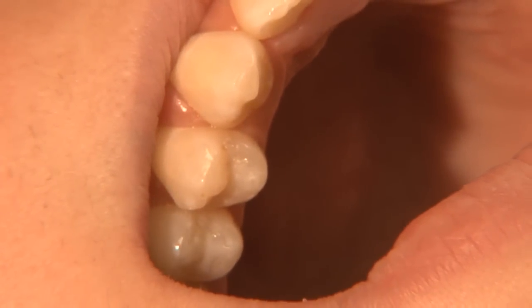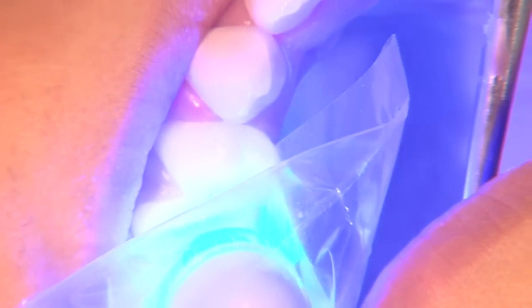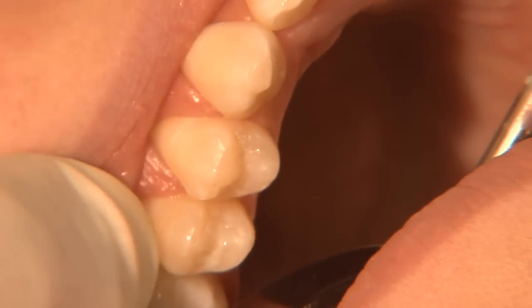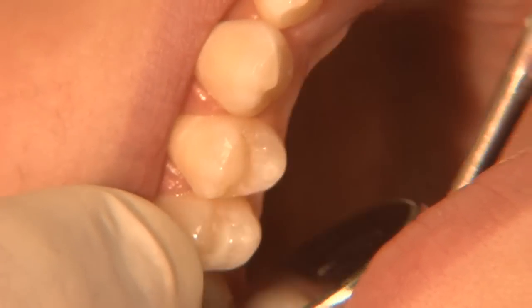After it has been properly placed, it is then light cured for approximately 20 seconds. After that, it presents a nice white opaque appearance that can be seen clearly. The occlusion or bite is then checked, and at that time any adjustments are made.